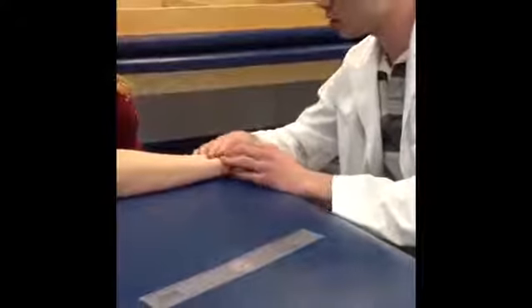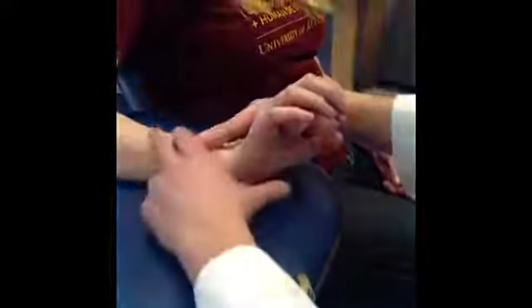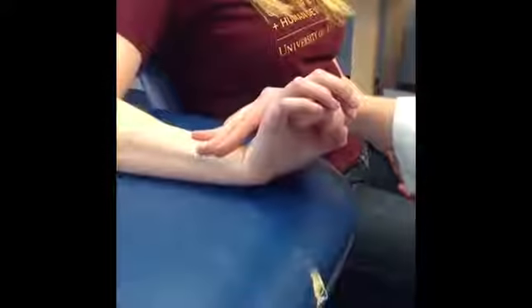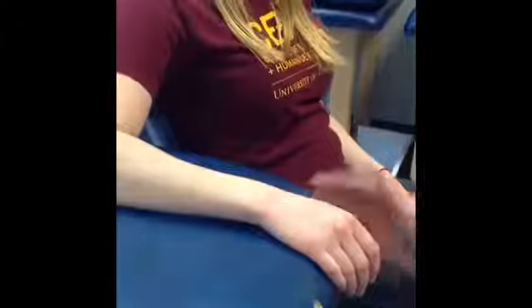And then I'm going to come in, and I like to use the table as support, and then also just come with your thumb and go across the radial or the metacarpal heads, and still I'm stabilizing with all 3 fingers here. And right there I do feel a firm end feel, so that's where I would measure. Any pain with that at all? No. Okay, perfect. So now we're going to go into the actual goniometric assessment.